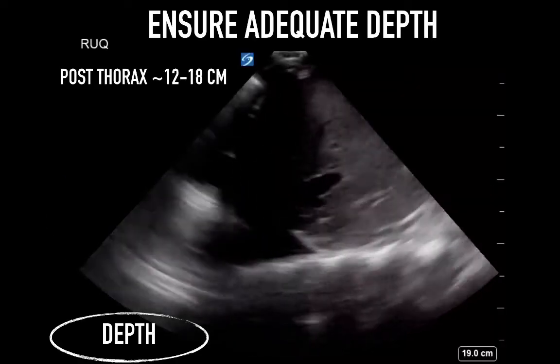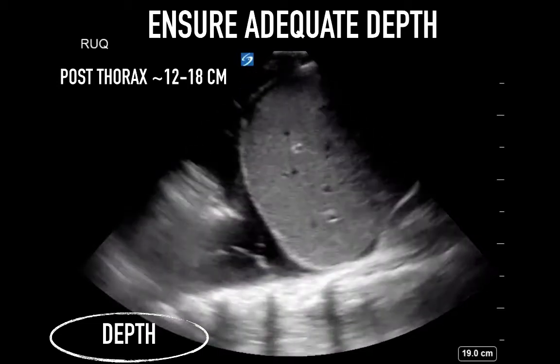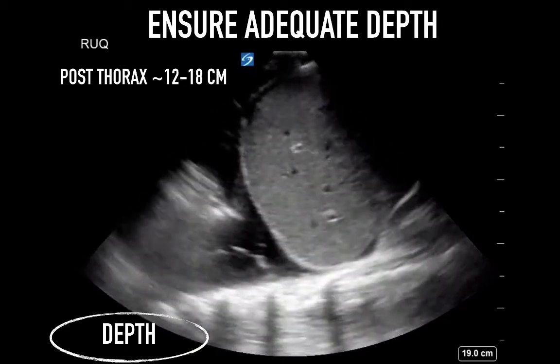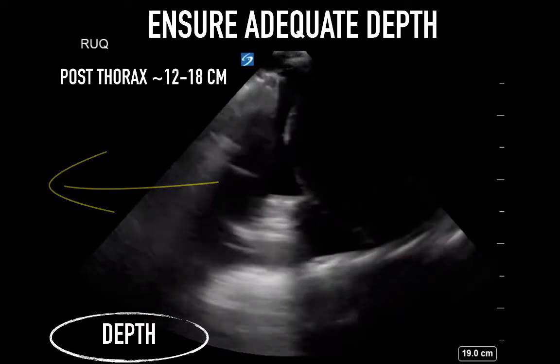In the posterior thorax, we aim for about 12 to 18 centimeters. What I really want to see is the posterior spine, as this gives us a sense of the anatomical orientation and acquisition. Again, we can see here that cephalad will be screen left and caudal, or towards the feet, will be screen right.